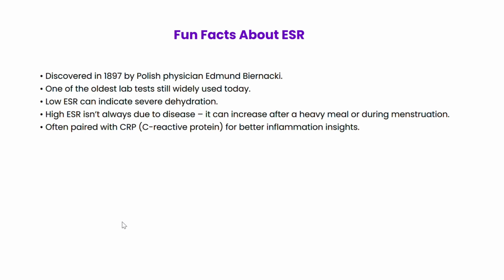And interestingly, a high ESR does not always mean disease. It can also increase temporarily after a heavy meal or even during menstruation. Finally, ESR tests are often paired with CRP or C reactive protein tests for a more detailed picture of inflammation.